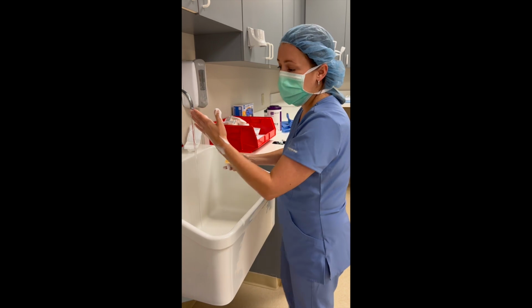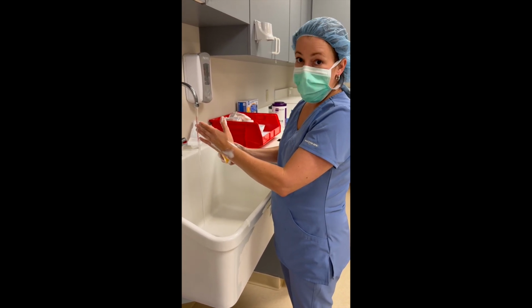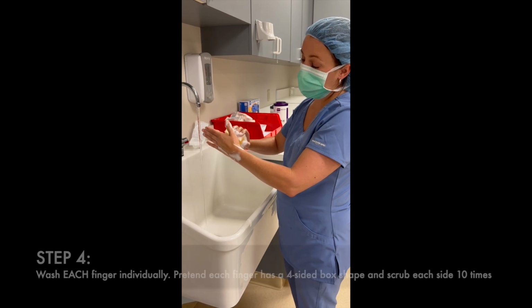Now I'm gonna do each individual finger. I'm gonna treat each finger like it has four sides, and I'm gonna do it 10 times. Remember, forward and back is one stroke, okay?